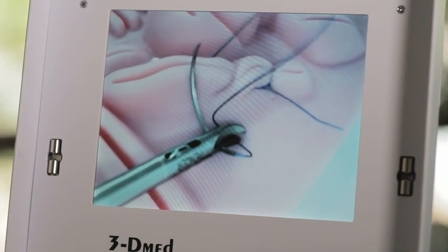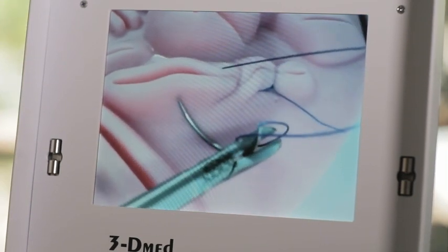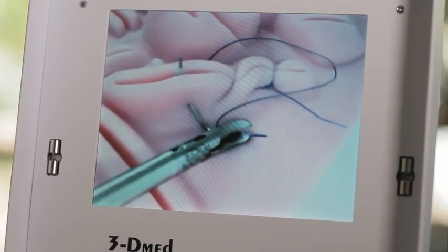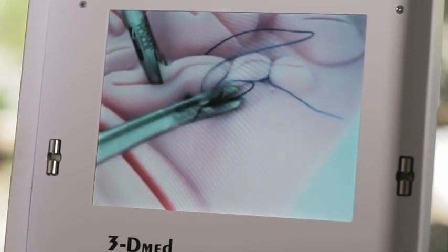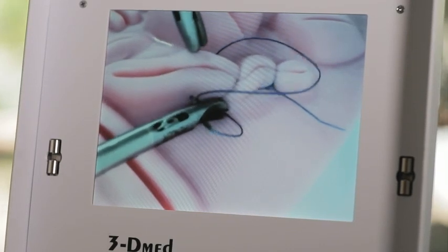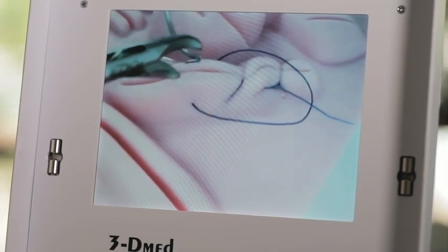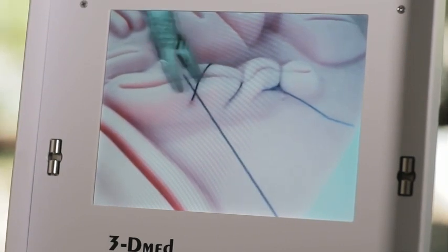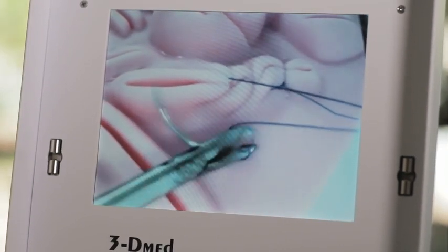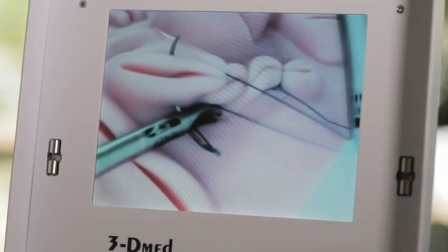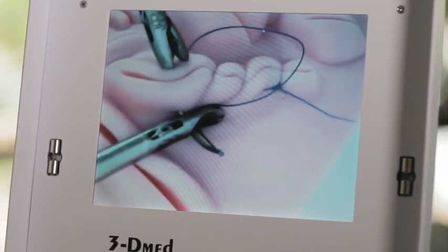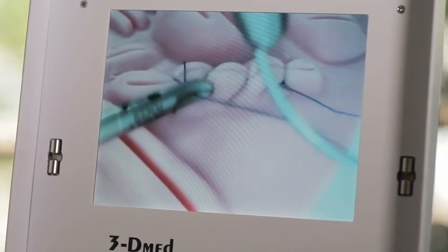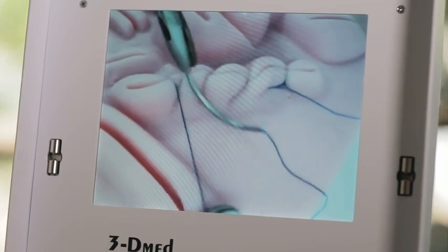If this were a cystotomy, one of my colleagues would be keeping this tissue under tension. Since it's just me, I will put it under intermediate tension so that I have a nice line of closure. It's going to come a little undone each time and I will adjust the tension each time. We will pass it through. Maybe at some point I can get both bites at once. We'll tighten it again. This is a good suture line. This would be watertight.